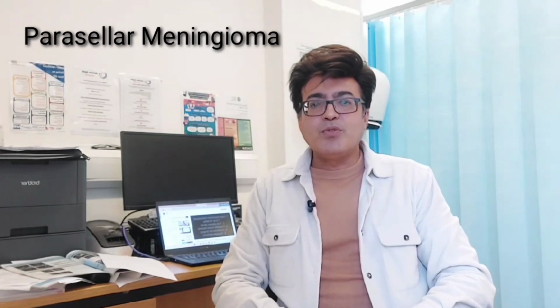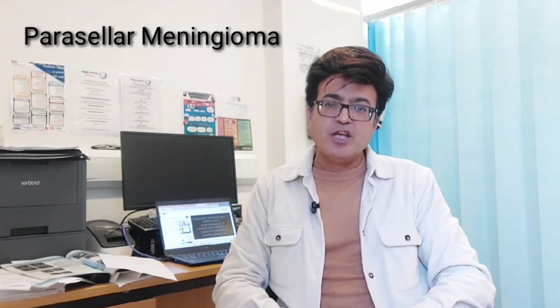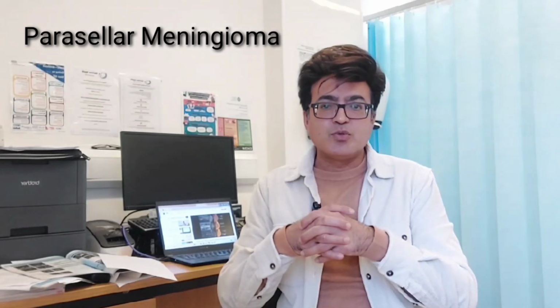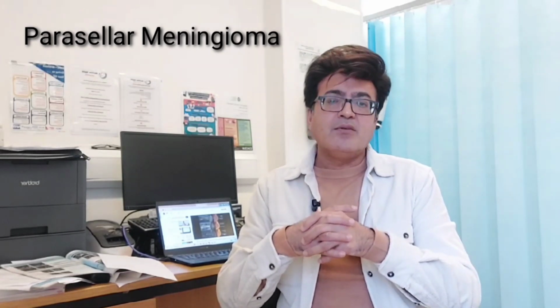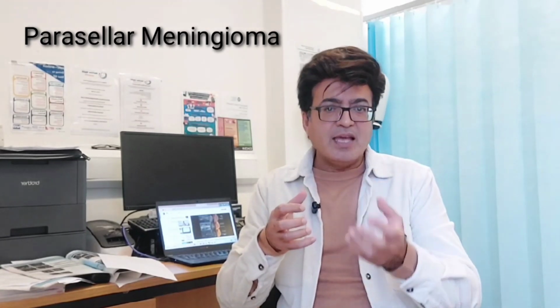I'm going to talk about the parasellar meningioma today, which is arising from the dura mater of the cavernous sinus tuberculum. This parasellar meningioma will give rise to symptoms of visual disturbance and cranial nerve palsy. As far as its radiological features are concerned, you may be able to see a well-defined and enhancing mass.